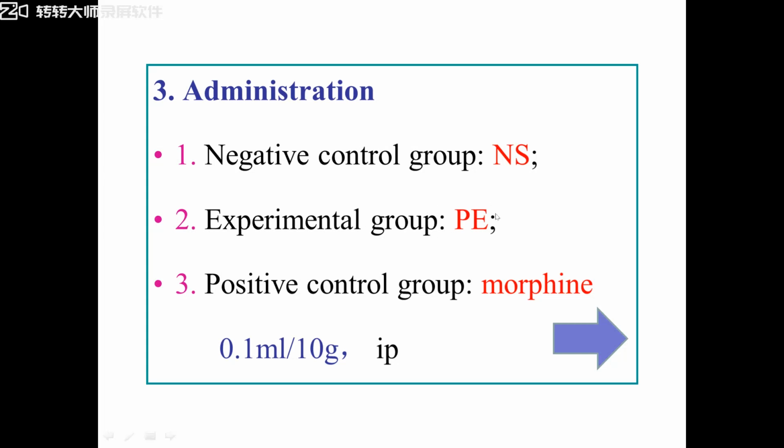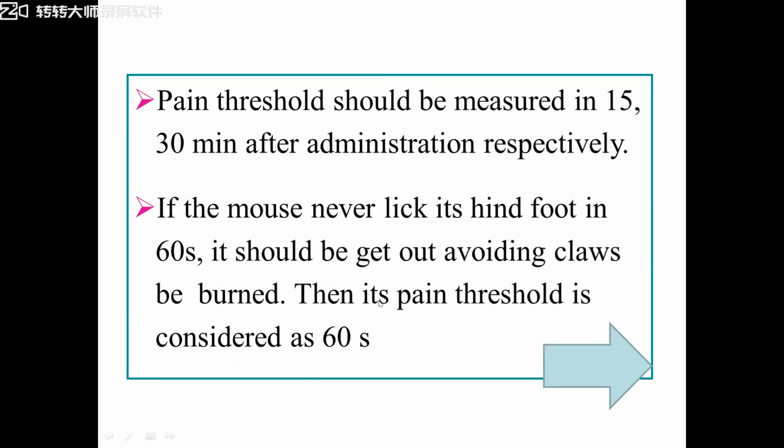And after we inject PE, if the pain threshold is prolonged to 40, 50 seconds, we can know PE, compared to itself, has analgesic action. And then compared to morphine, we can know whether PE has strong or weak analgesic action. Understand? Okay, so let's do the lab.